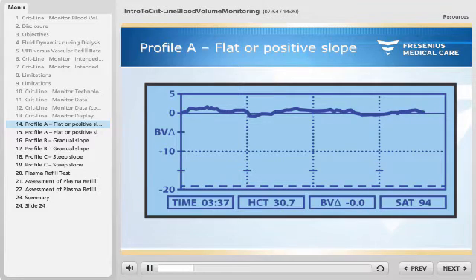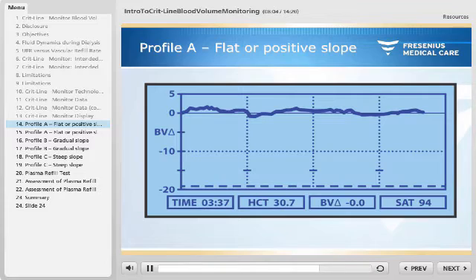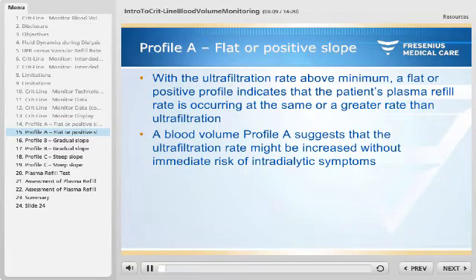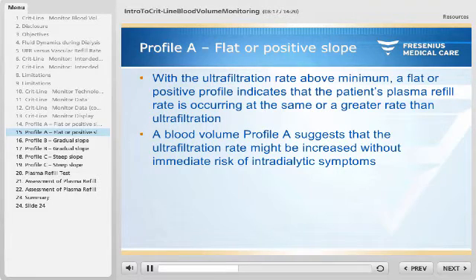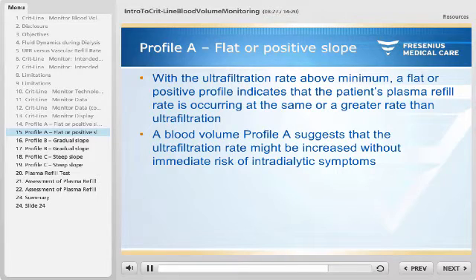The first example shows a sometimes slightly positive or negative, but on average flat curve, with no cumulative blood volume change at the end of treatment — also referred to as blood volume profile A. With the ultrafiltration rate above minimum, a flat or positive profile indicates that the patient's plasma refill rate is occurring at the same or a greater rate than ultrafiltration. A blood volume profile A suggests that the ultrafiltration rate might be increased without immediate risk of intradialytic symptoms.